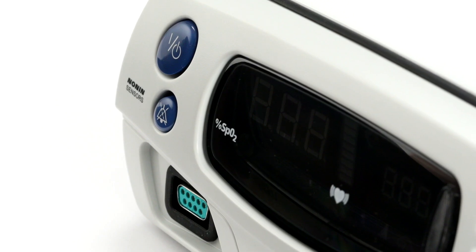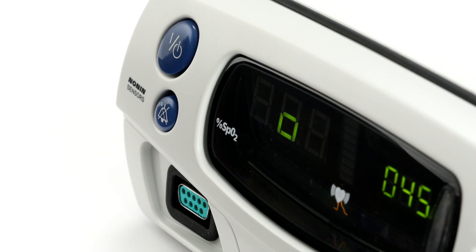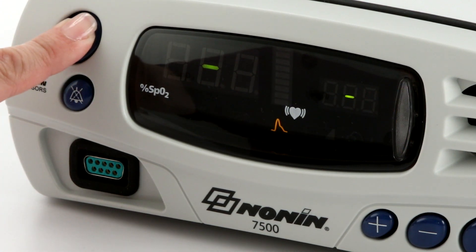Press the on-off button to start the unit. The oximeter will run through a power-up initialization as it turns on. Watch to ensure all the LED elements and information appears as shown here. If any LED elements do not appear, or if any of the displays do not appear as expected, power the device off.